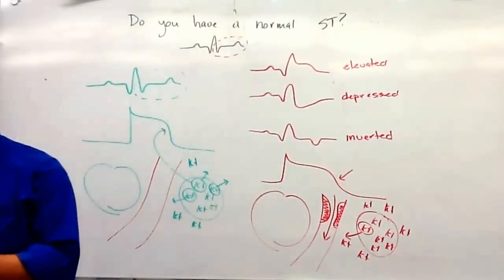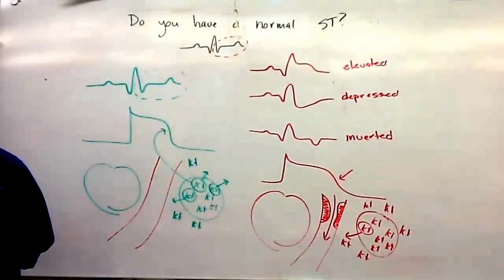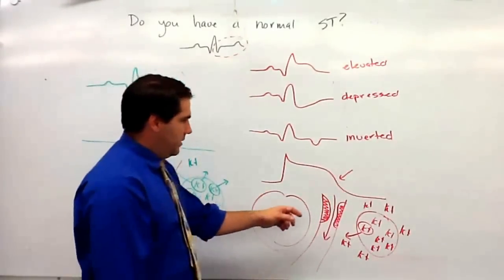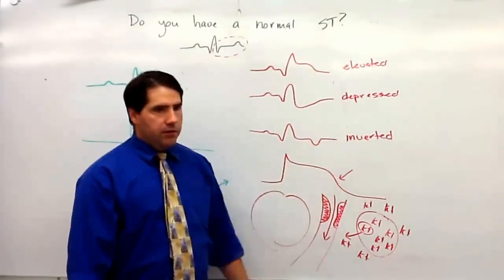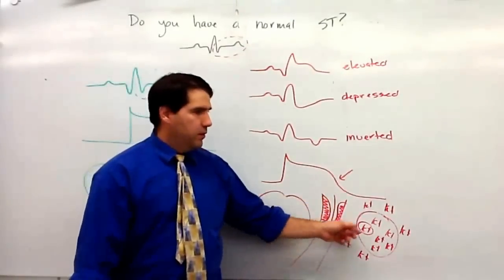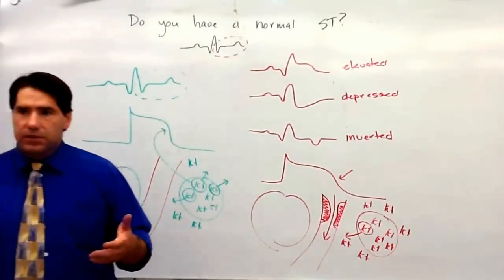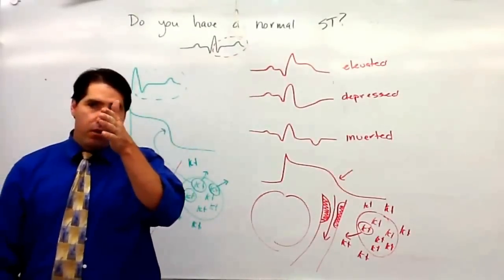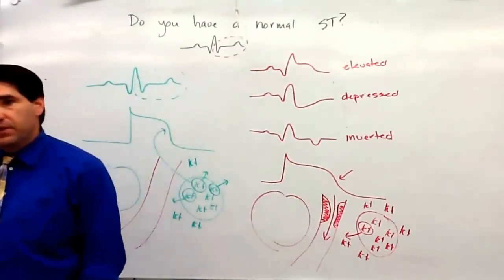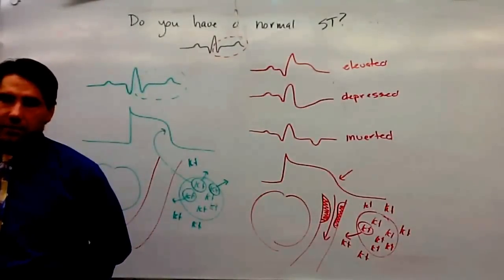So it happened to my dad, happens plenty of times. Dad went in to get a stress test and he got admitted that day and bypass was scheduled the next day. So my dad went in, got a stress test, had an inverted T. The inverted T tells him that he is not getting enough blood flow to wash out potassium, so repolarization is ineffective. The big change is, it has to happen from not on the treadmill to on the treadmill, if the T wave changes. So if your T wave changes with stress, that indicates you don't have enough blood flow to your heart.